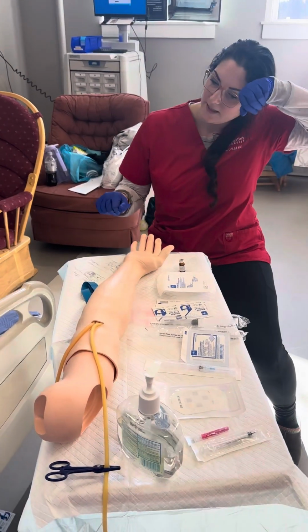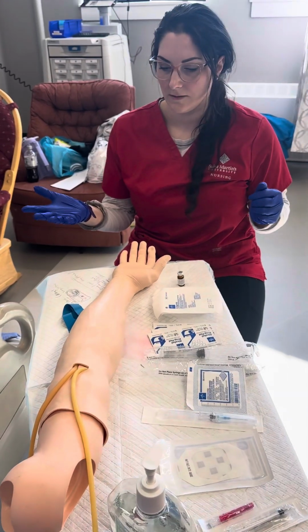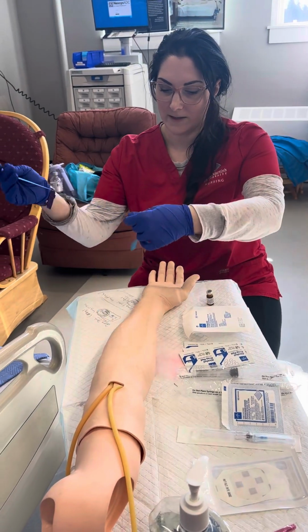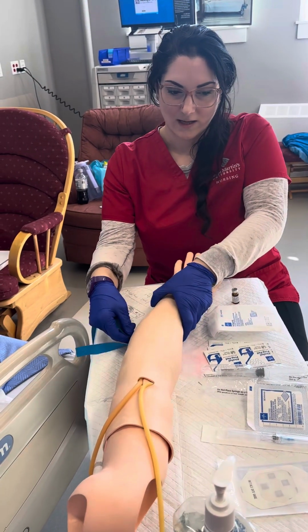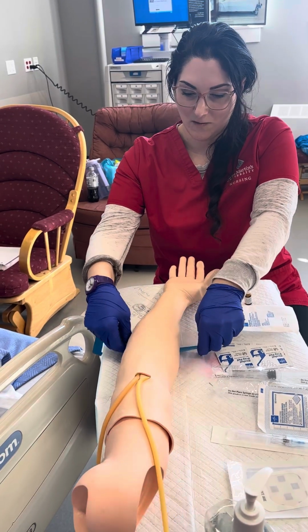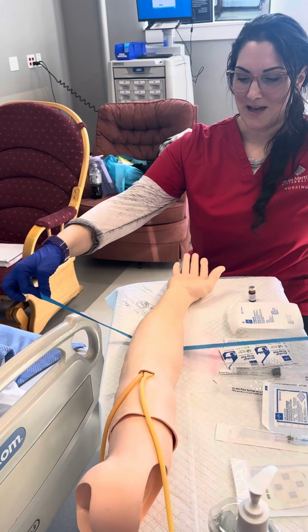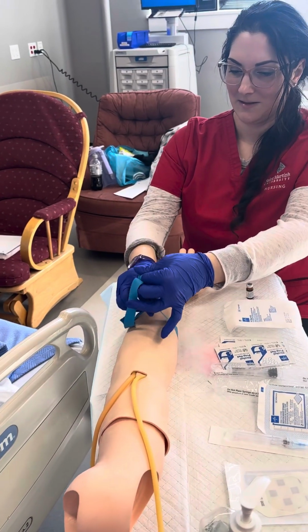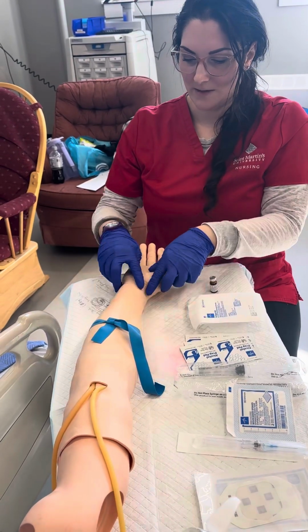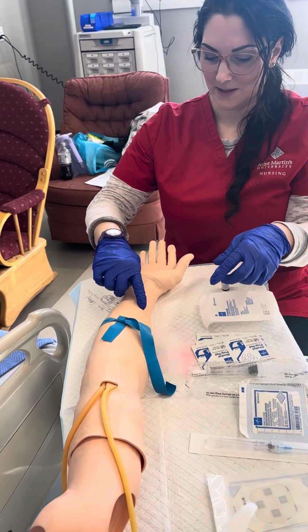I'm going to ask you to go like this and get the blood flow going. I'm going to be inserting a catheter in you. It shouldn't hurt that much. This is the arm you want, all right, because you gave it to me. It shouldn't hurt that much. Just a little pinch. All right, check for radial pulse. There it is. That looks like a good vein right there.